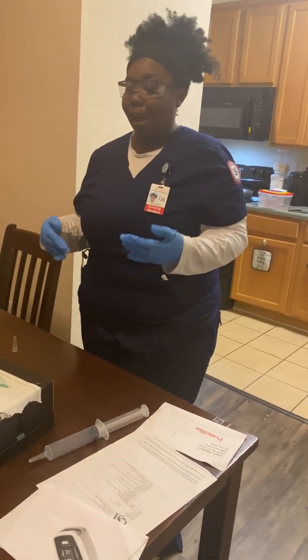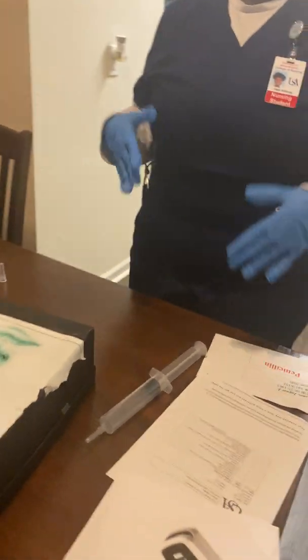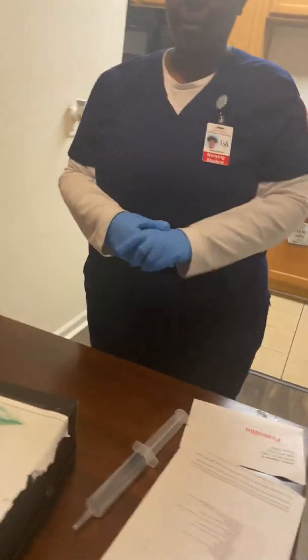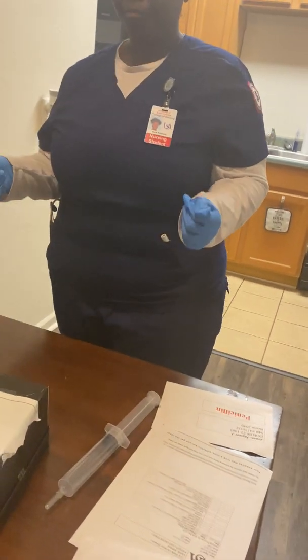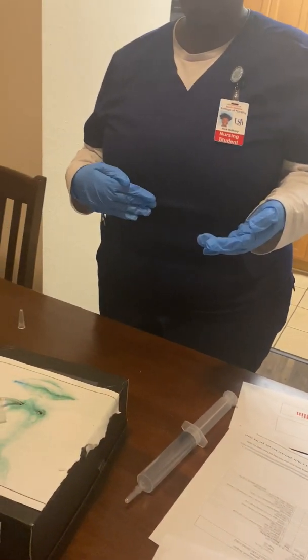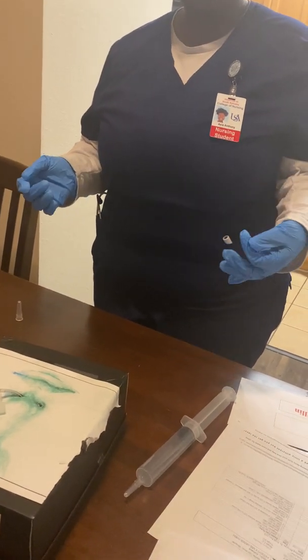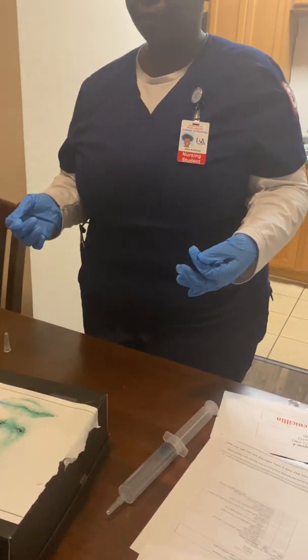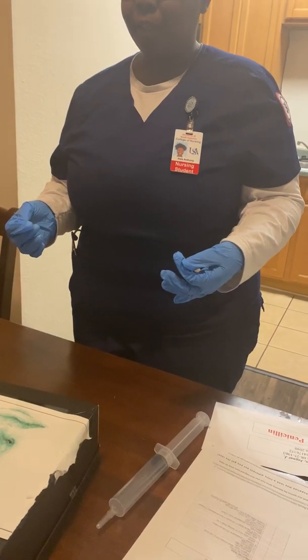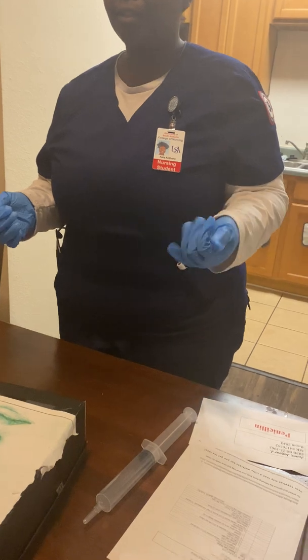NG tube, I would come into the patient's room, I would verify the order, I would explain the procedure to the patient, I would perform hand hygiene, and then I would auscultate for bowel sounds, and then I would disconnect from the gown. And once I disconnected, I would turn the suction off.